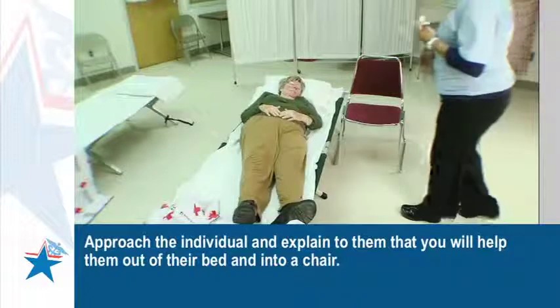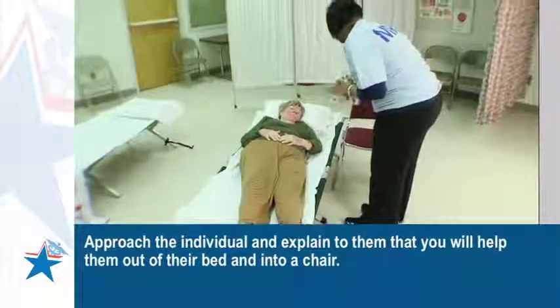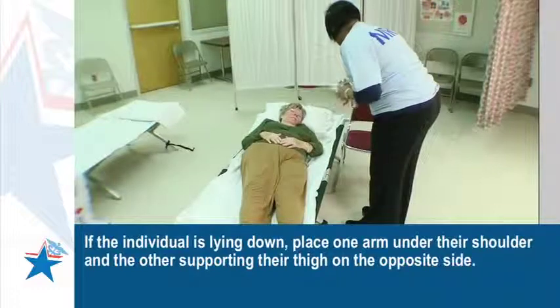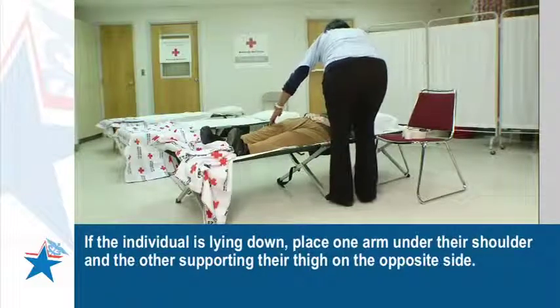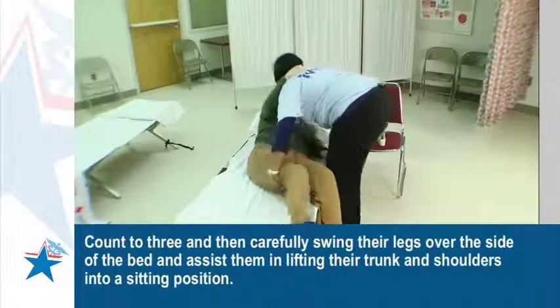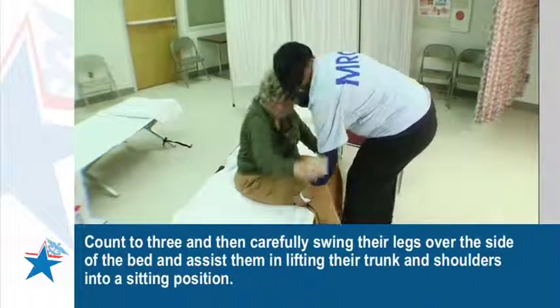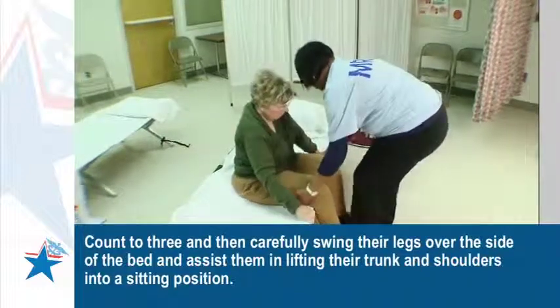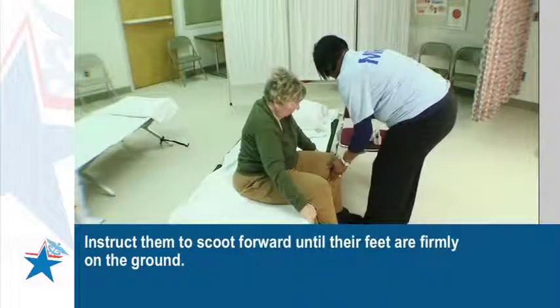Approach the individual and explain to them that you will help them out of their bed and into a chair. If the individual is lying down, place one arm under their shoulder and the other supporting their thigh on the opposite side. Count to three and then carefully swing their legs over the side of the bed and assist them in lifting their trunk and shoulders into a sitting position. Instruct them to scoot forward until their feet are firmly on the ground.